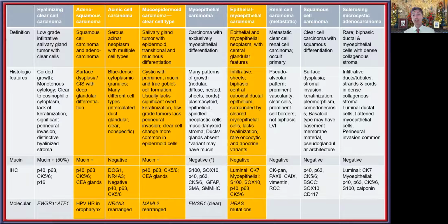But again, you can see that there are focal areas suggesting glandular differentiation or at least lumen formation of a neoplasm. However, in this case, I think it's a little bit more obvious that you have genuine and well-developed glandular formation, and you will notice here it is a higher grade tumor. So as I've already suggested, the adenosquamous does tend to be a high-grade tumor, and so it'll have lots of mitotic activity, areas of pleomorphism and even tumor necrosis.